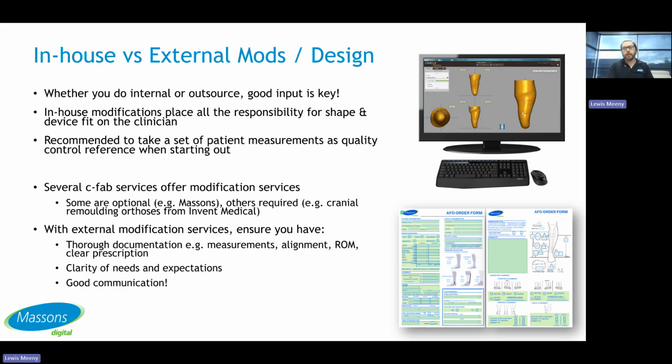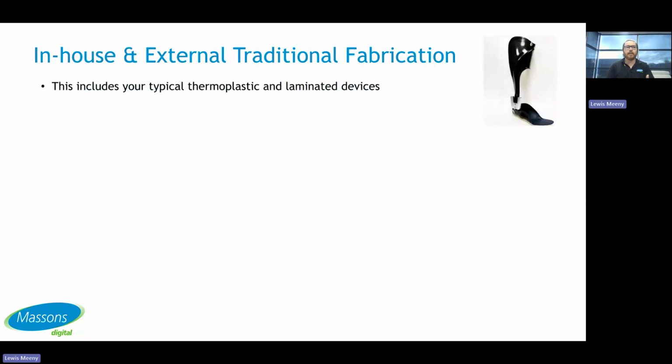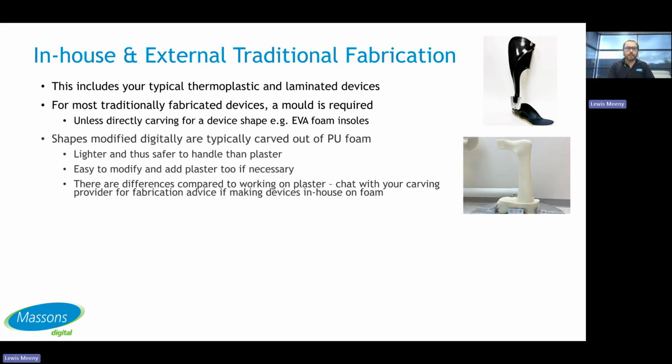So following on from the modification and design, when it comes to the fabrication of traditional devices, and when I say traditional, I'm talking about typical thermoplastic and laminated devices, for most of them, a mold is required. Unless you're carving directly for a shape like EVA foam insoles, we normally need a mold to work off of. Shapes that have been modified digitally are carved out of polyurethane foam.